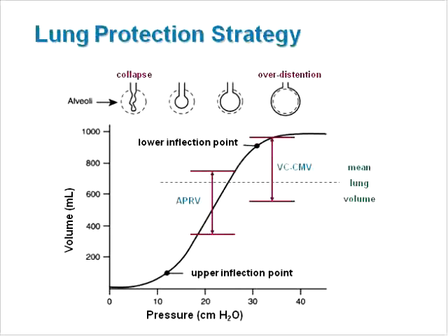Volume control requires higher tidal volumes to attain the same mean lung volume because it uses lower I:E ratios. Trying to increase the I:E ratio with volume control requires increased sedation to suppress the patient's desire to breathe against the ventilator. Of course, volume control could be operated with the same end inspiratory and end expiratory volumes, but it would result in lower mean lung volume and presumably lower oxygenation.